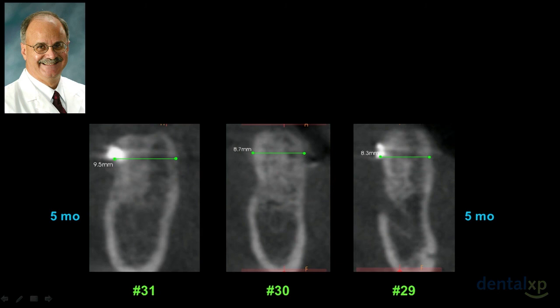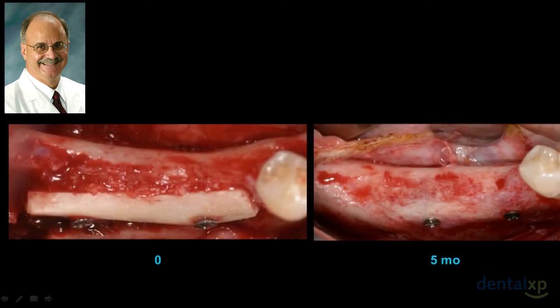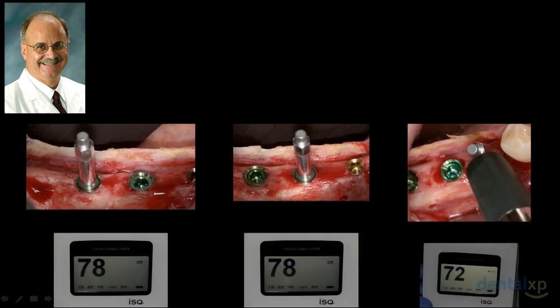And at a 5-month follow-up, we can evaluate with a post-graft scan exactly how much bone volume we have. So there's no surprises. On the left, you see time 0, then 5 months, there's our bone. We can compare quite nicely, quite dramatically, and this is case to case to case. And not just myself, and certainly not just Craig Misch, but others can do and duplicate the same thing. And that's what science is all about, that these particular grafts work well.